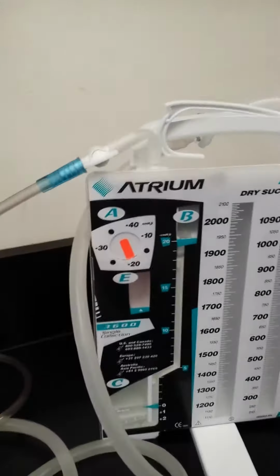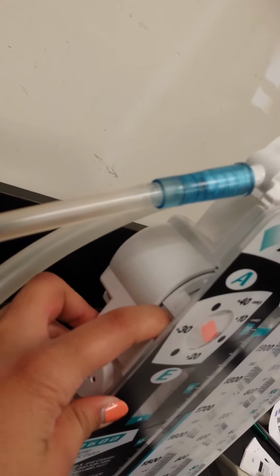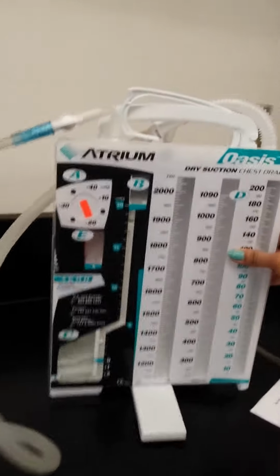Okay, and then that's everything set up. And when you want to make sure suction works, you want to set this to 20. No, it's with this one. This one, you set it here. You have to turn this dial in the back. You can turn it up and down depending on where you want to go, and then it moves. So where we want it at 20, okay, so it's set at 20. So then with that, that's good.